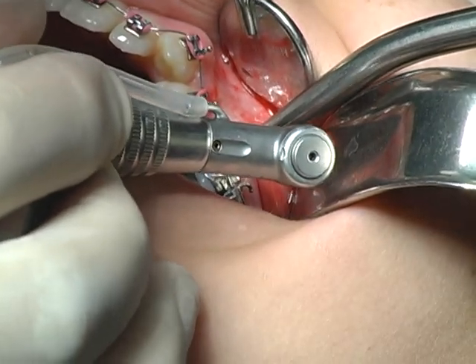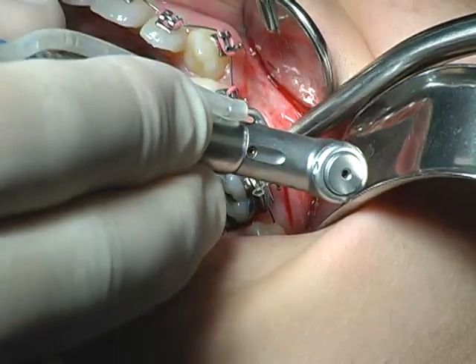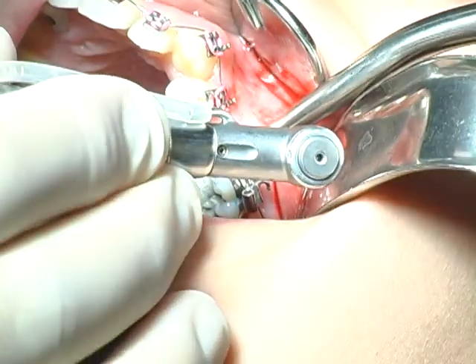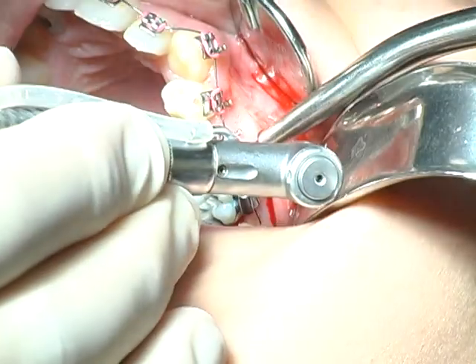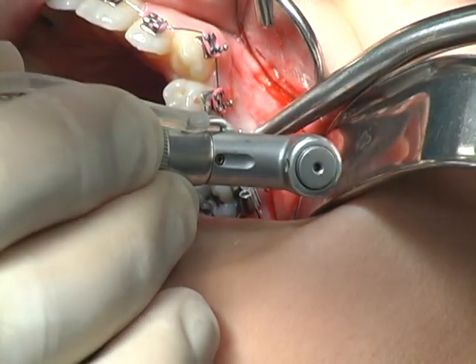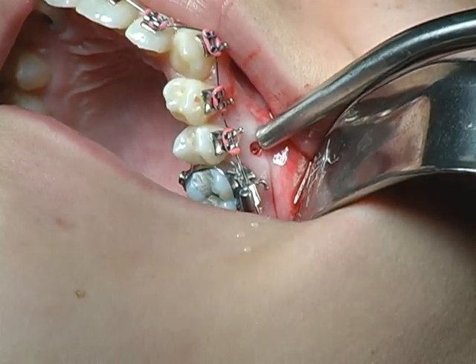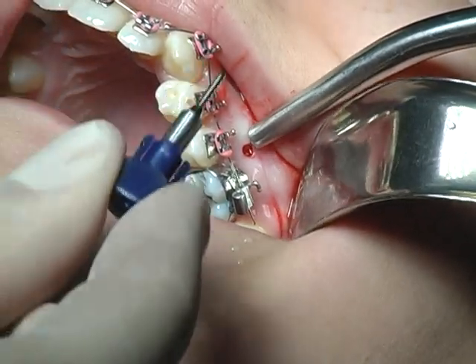Now I'm looking for my pilot drill again. Open as far as you can. I have to make sure that I'm again in the right direction. We do again 850. And that's it.